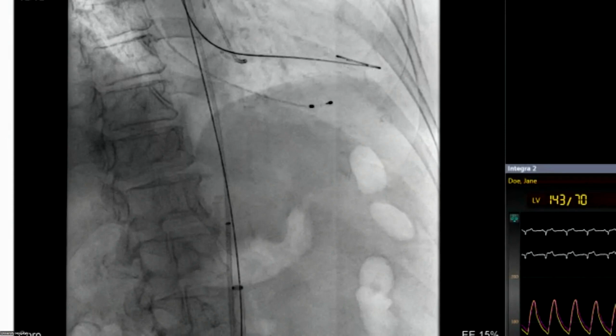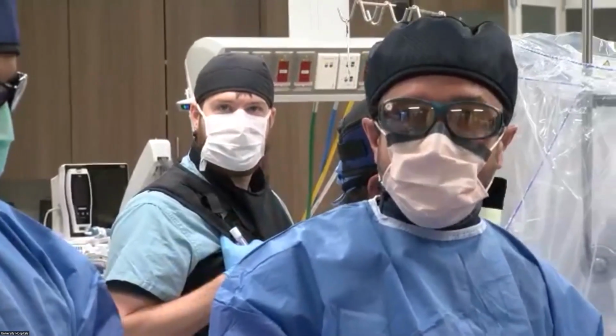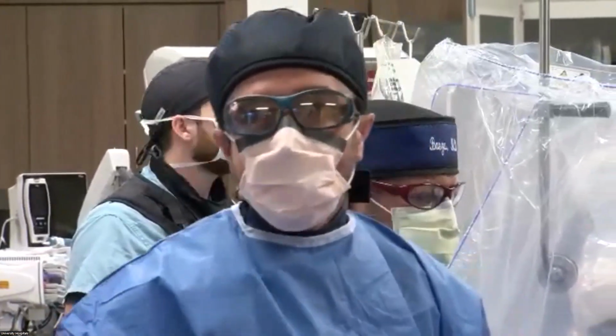Another reason is because our patient's awake. She's mildly sedated. If I talk to her, she's going to respond to me. And if we go radial and start having spasm in the radial with the patient awake, and we are across the valve, then it becomes a stressful moment without need.